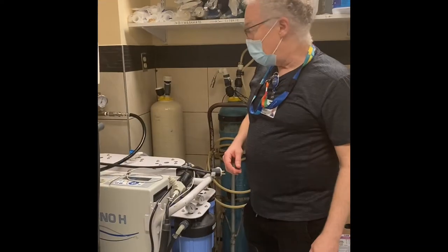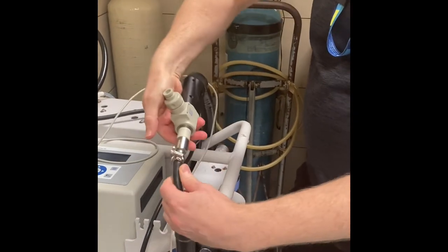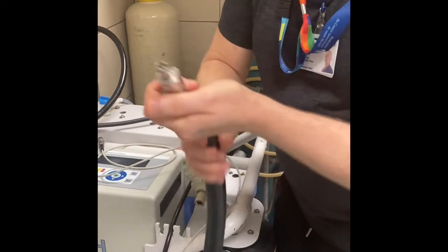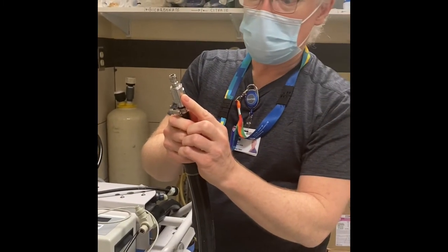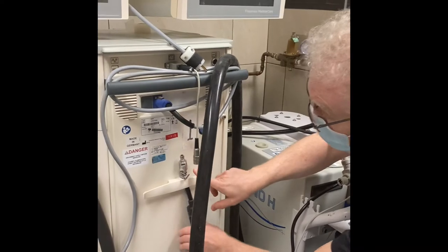Water supply. The quick connect between the Aqua Uno and the dialysis machine is here. Pull back on the little grey collar and they'll disconnect. This needs to be kept clean — this is your water inlet supply. Don't let it drag on the ground. It can hook up on the back of the machine.